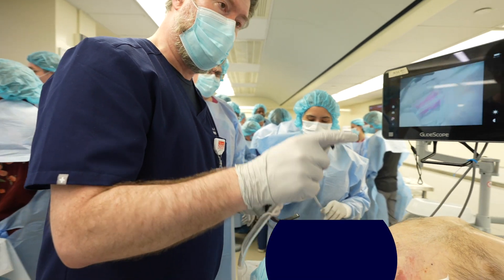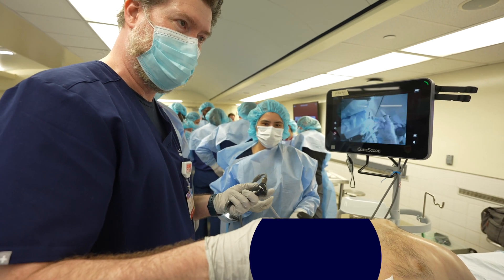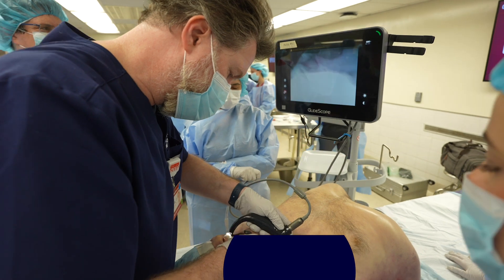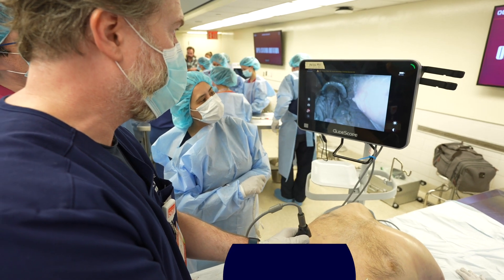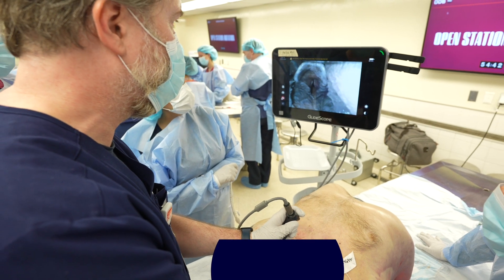So this is what it looks like. I'm going to hold the tube in my hand because I never want to let it go — I don't like other people holding the tube. I'm going to scissor open, look in the mouth, and find the uvula. The uvula is my north star; it points my way to the epiglottis. Epiglottis comes into view.